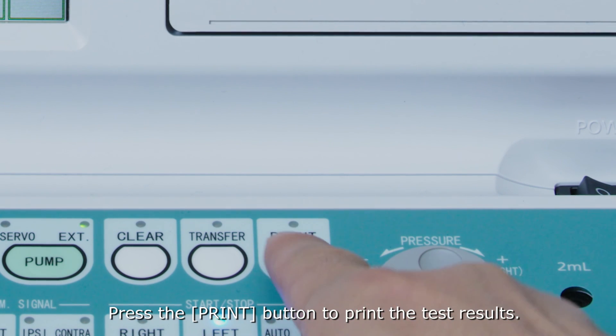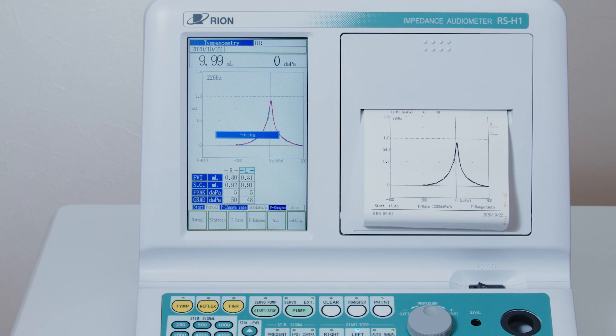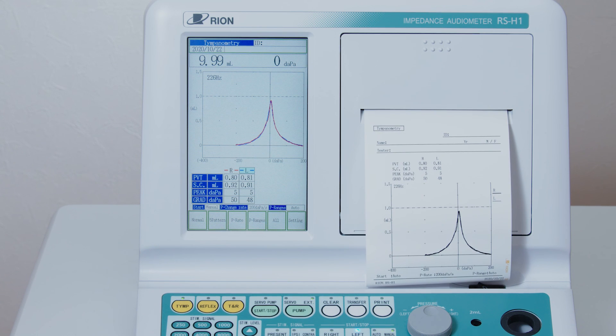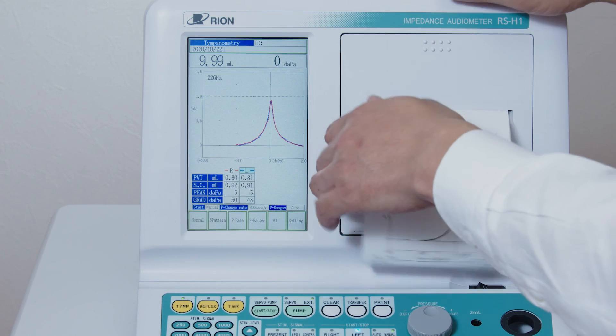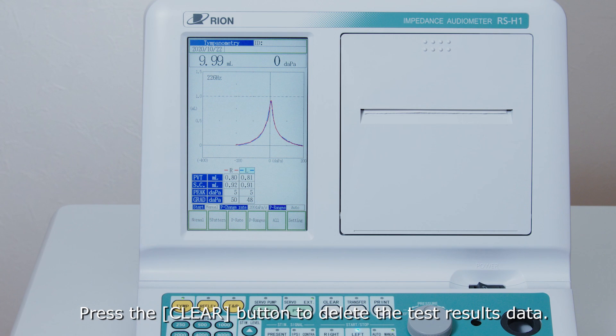Press the print button to print the test results. Press the clear button to delete the test results data.